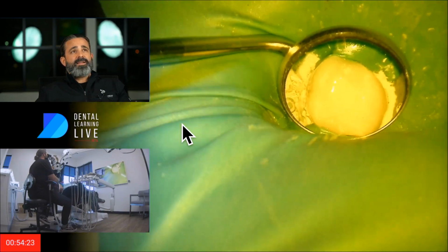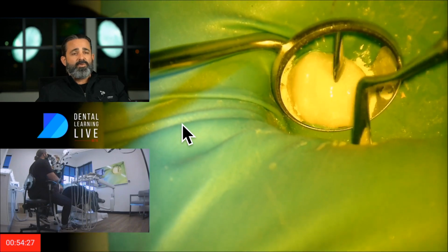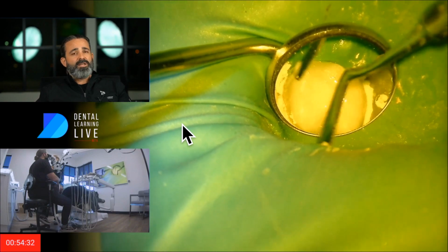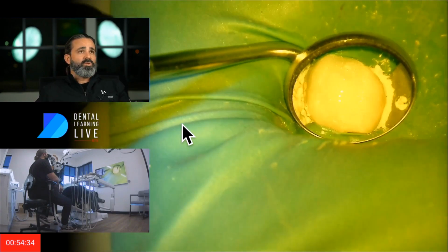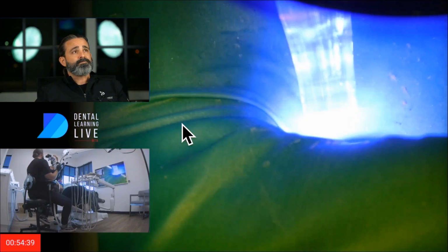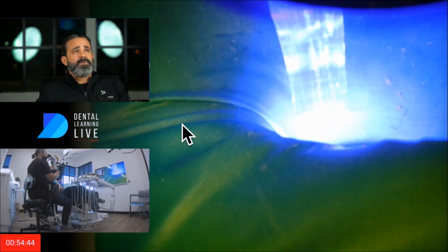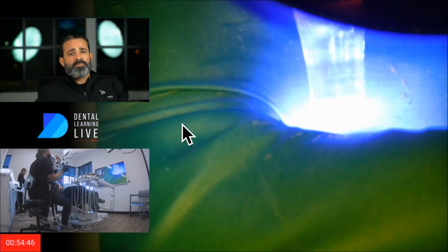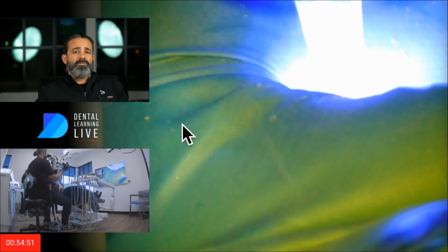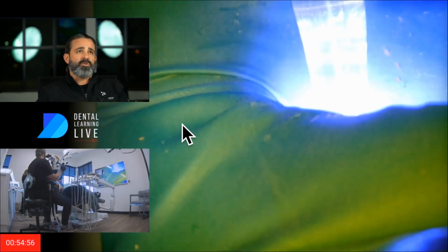So after that, I did a bonded technique. If you watch my videos, I'm using the same technique you've seen before. It's a two-step bonding protocol with a conditioning agent and then the bonding agent with a light cure. And then I'm using a dual cured core material inside this crown. I've had a lot of years with this product, so it's weathered the oral storm, and the storm of the marginal junction between the crown and the restoration.